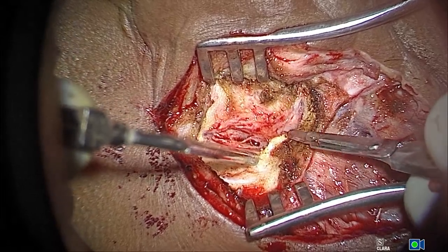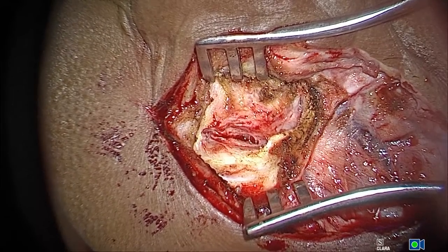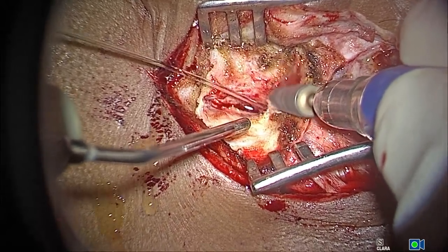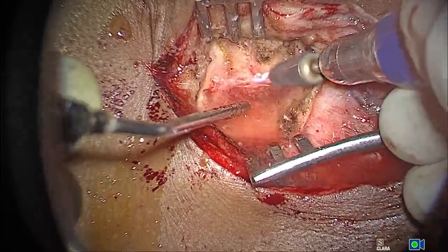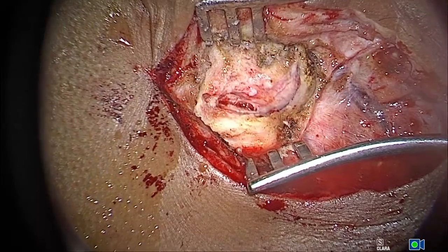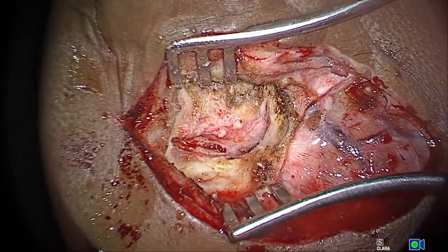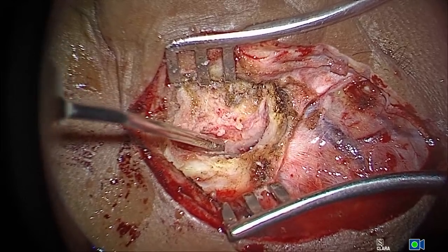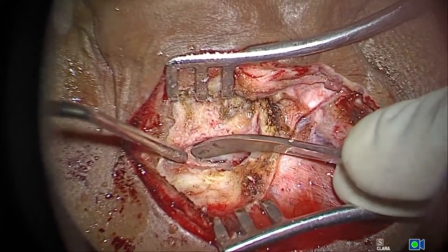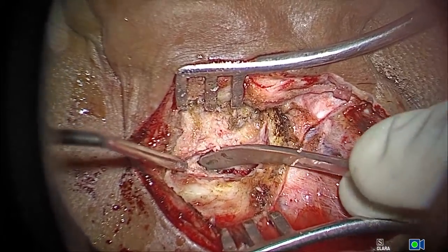So this Henle spine might obscure my view, so I'm just going to drill it off. This I always do. If it is a big Henle spine, I just drill it off. That's it. Actually not a canaloplasty, but just a little, you know, to get a better exposure. Right. Now, give me an elevator. Now you can see how it's opened up the canal for me. So that's the posterior canal wall skin.